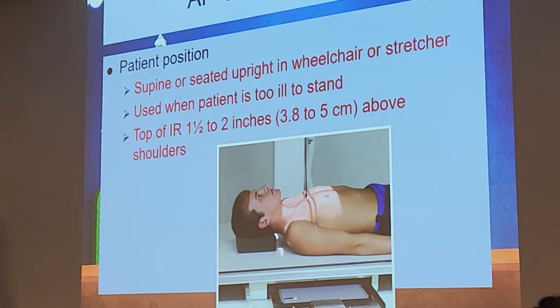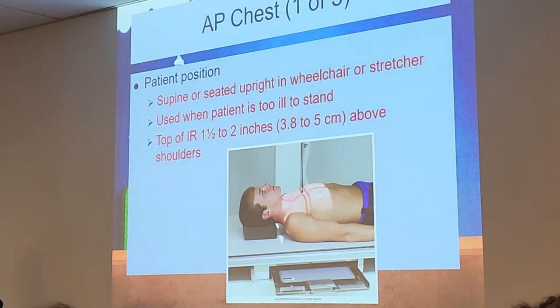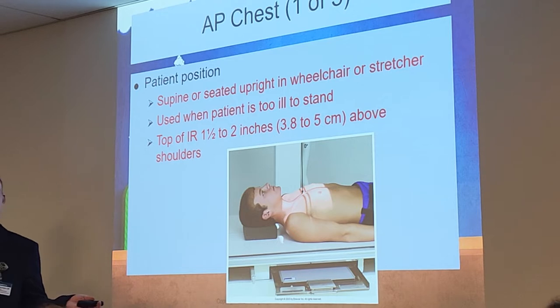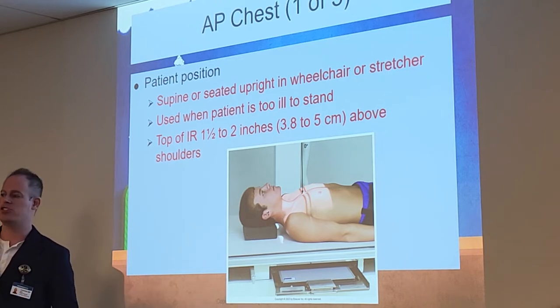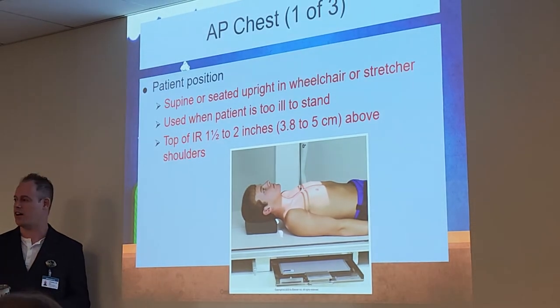All right, AP chest. Now, why in the world would we ever do an AP chest? You want to wager a guess? Why would you do an AP chest instead of a PA chest? Patient can't stand up. If the patient cannot stand up, which is actually quite a bit of patients in the hospital because they're stuck in beds, right? So most of your AP chests will be done with portable x-rays, like the old portable machine in that room over there. So you guys are going to get much nicer machines at the hospital.